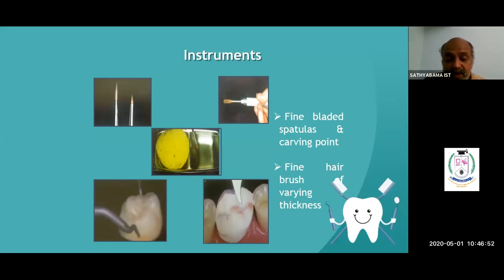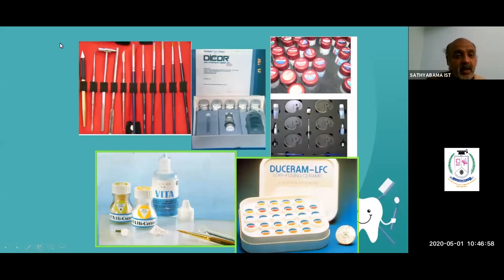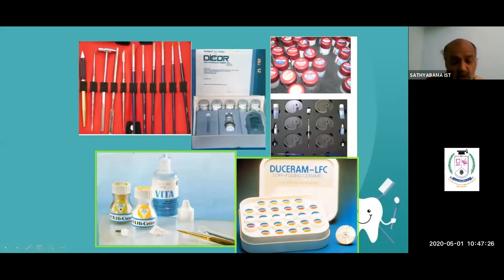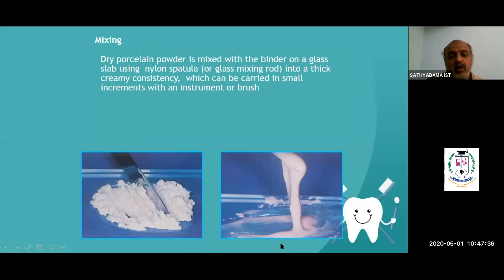We have brushes of various thicknesses for use with ceramic. This is the perfect kit: you have the blades, spatula, condenser, and various sizes of brushes. This is the Vita company ceramic kit. On the right-hand side you can see various powders of ceramic in different shades, which you can mix and match.